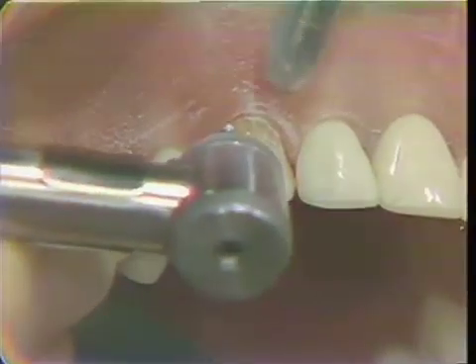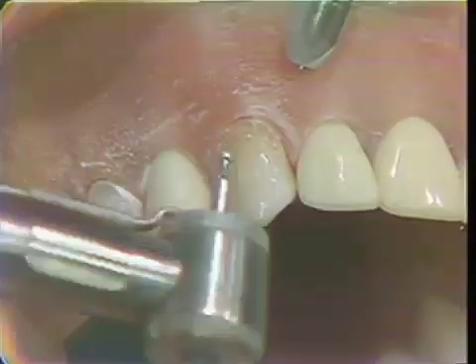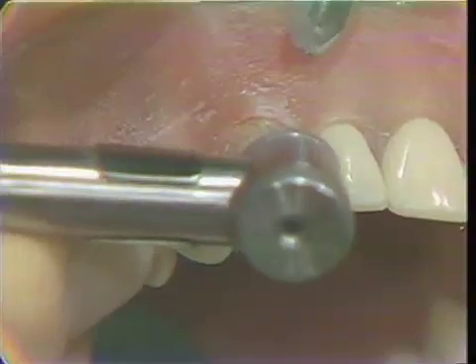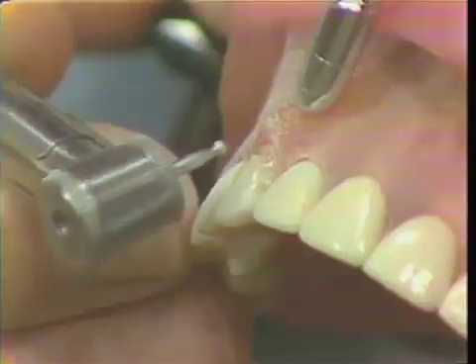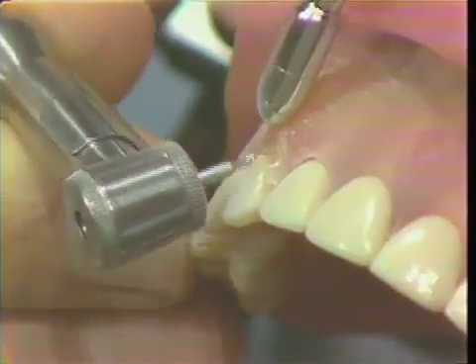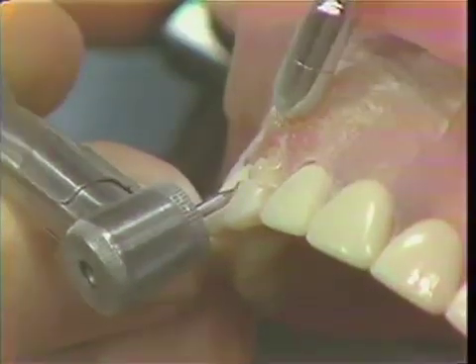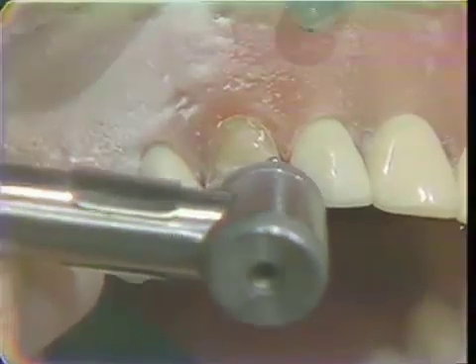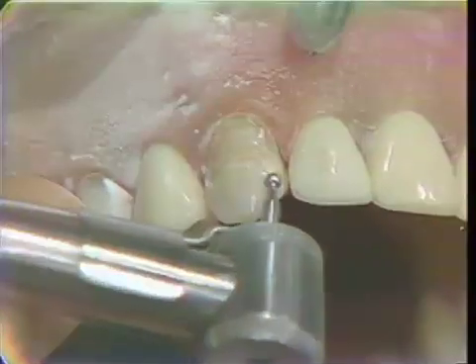When you hold the diamond like this and bury it right to the shank, you will see that the cut is pretty well self-limiting, and we will take this diamond into the inner proximal as far as we can go without nicking the adjacent teeth. We will make a cut halfway through the tooth in this area, taking it in approximately, and then one near the incisal.